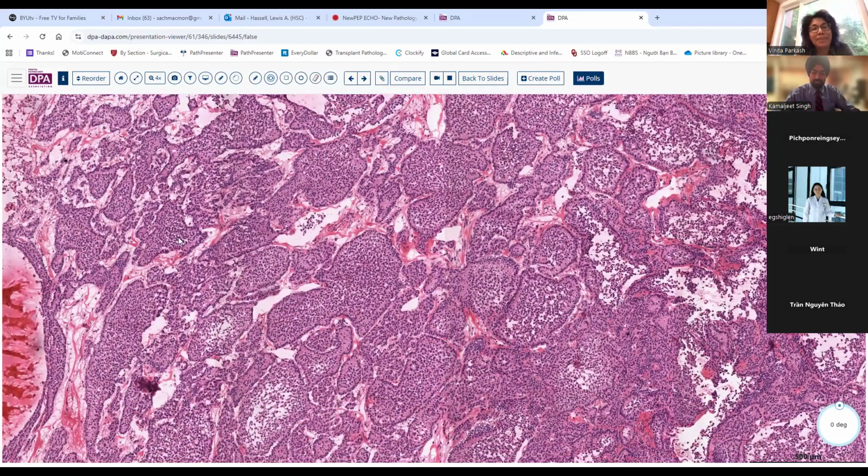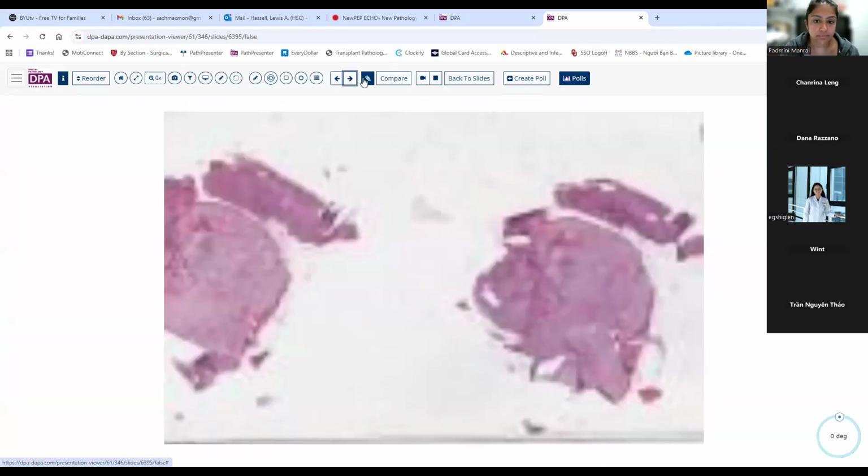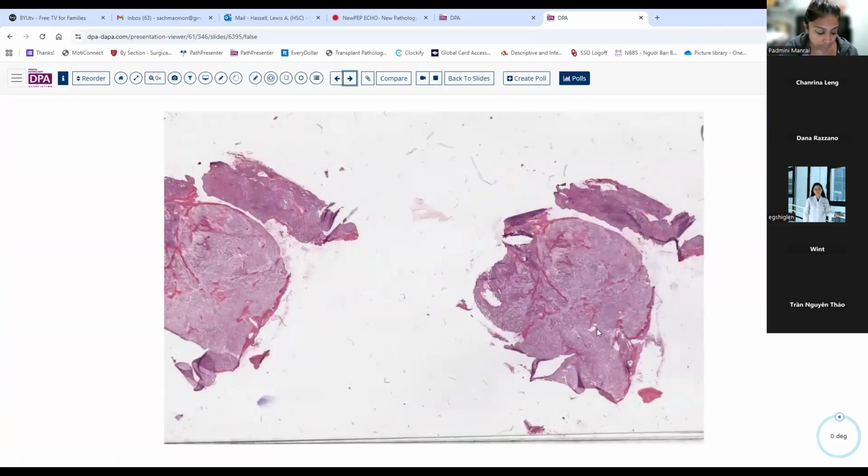Yeah, now typically in frozen section, we only get probably 2 or maybe 3 blocks if we're being really generous. And so we have to be very selective in what we sample. But I think the information that we've gathered here is probably enough to tell the surgeon what they need to do next. We've told them what our considerations are, and really almost all of those would entail some search for additional information or additional staging data on this patient. So good discussion. Let's go on and take another example here.